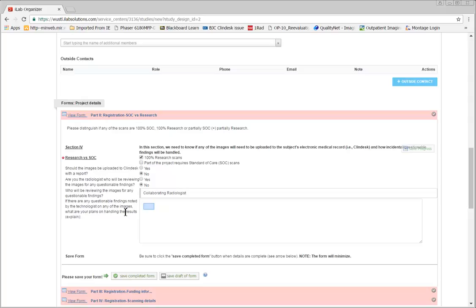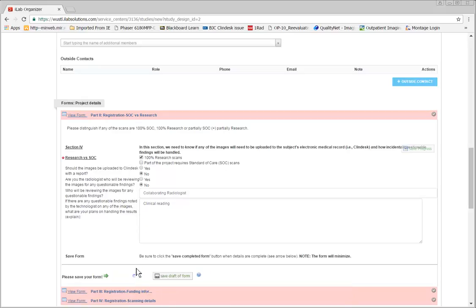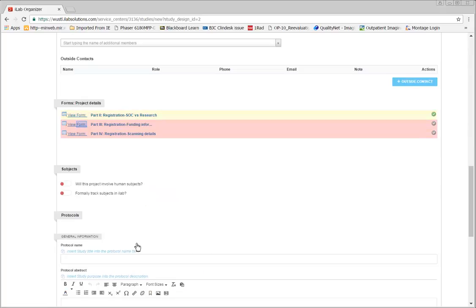Note that the red star indicates required fields. When finished, be sure to click the green Save Form button. Completed forms will have a green checkmark.